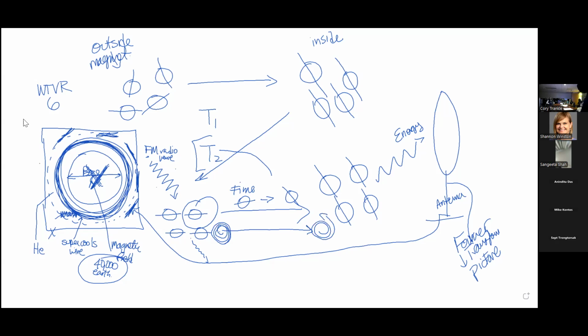And then when they go over to this space in their original, they unwind. Okay, so they wind this way, and then they unwind this way. And that winding and unwinding time is T1, right? It's really easy. That's not hard to think about at all, right?